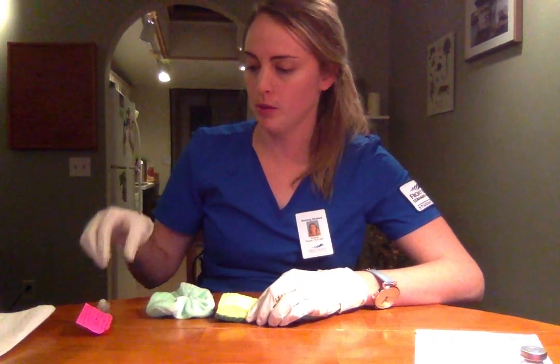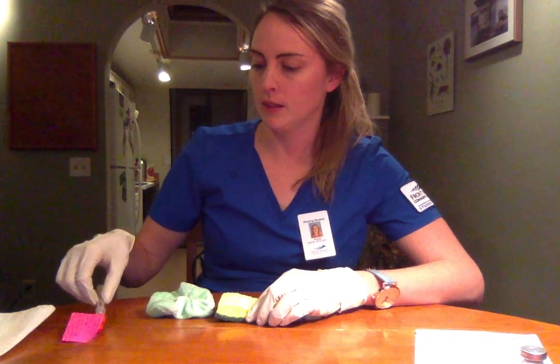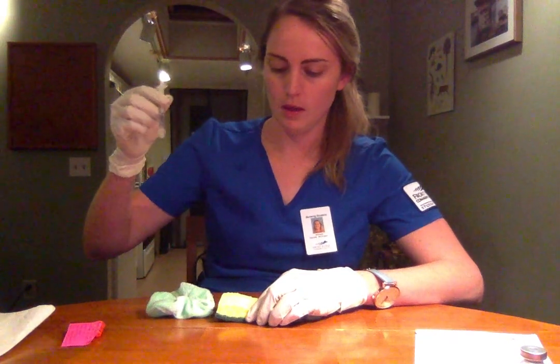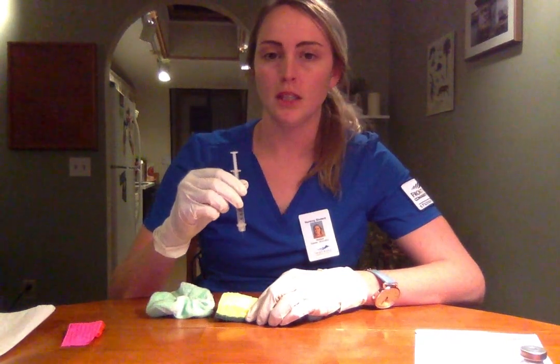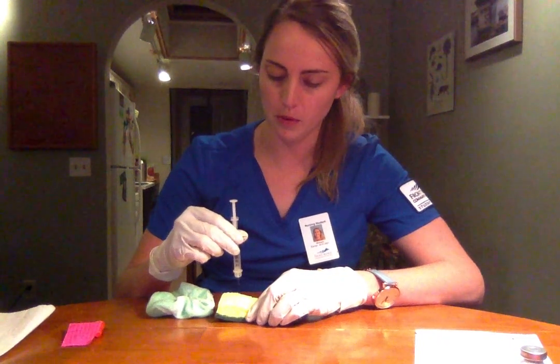Alright, so I'm going to tell the patient that she's going to feel a slight poke. So Abby, you're going to feel a slight poke in just a second. Okay. And I'm going to dart down at a 90-degree angle. Alright, Abby, you're going to feel the poke.